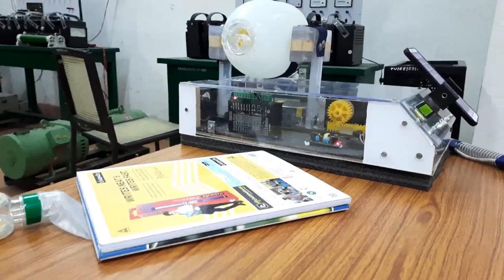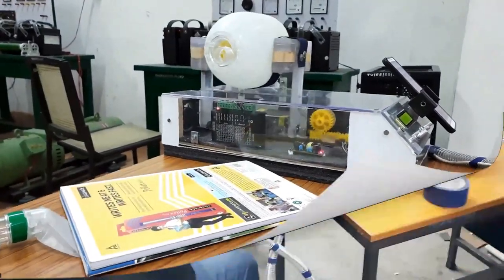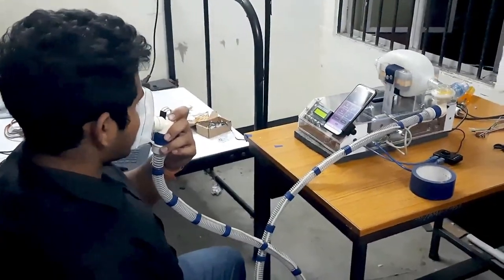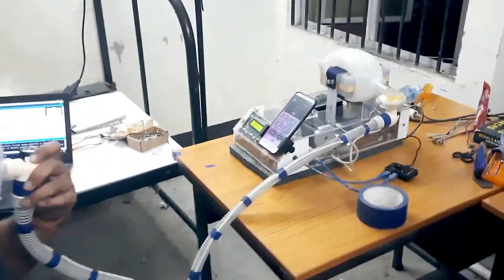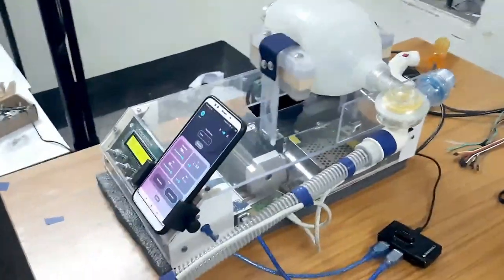The hardware can be categorized into three sections. Number one is the breathing circuit, second the mechanical system, and third the controls. The breathing circuit consists of the Ambu bag, the single limb breathing circuit, and the mask.